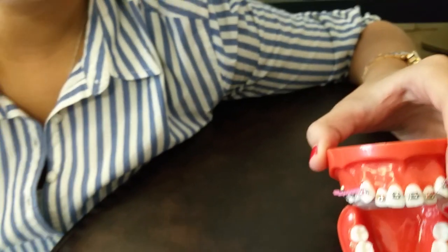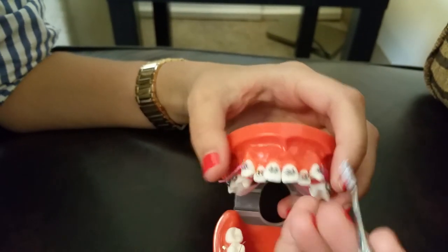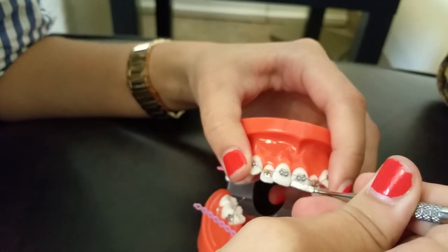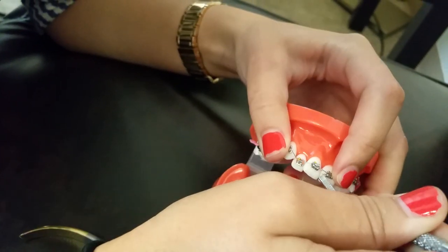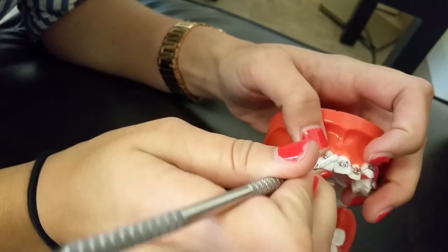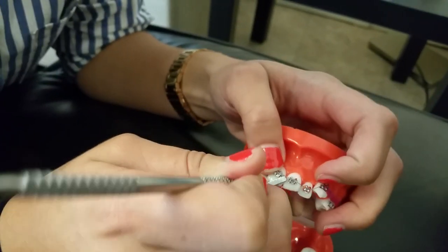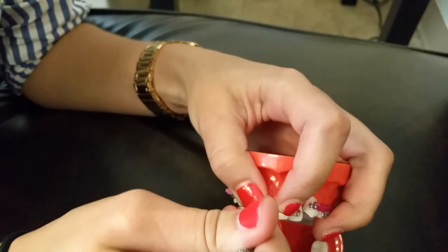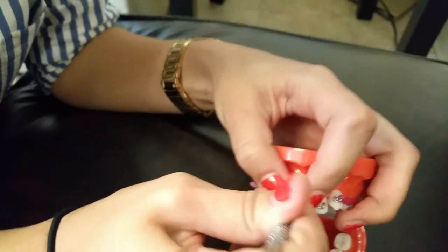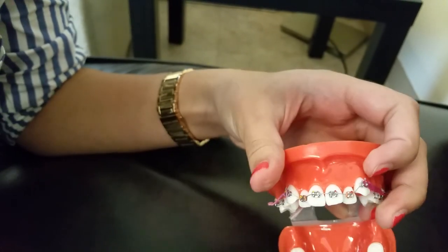You want to grab the scaler and use this end of it first to push down the little excess wire and guide it under. You have to be gentle because the patient can feel all of this. Same thing with the other one. Once you've got it low, use the other end of the scaler to tuck it in closer to the bracket so it's not in their way. Now you can't see it.